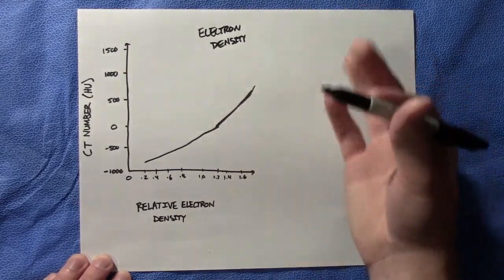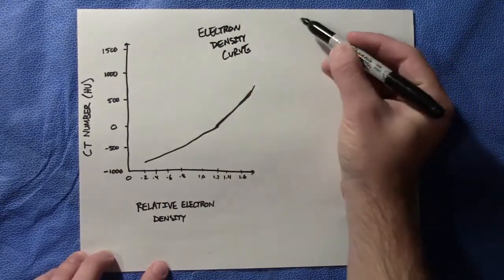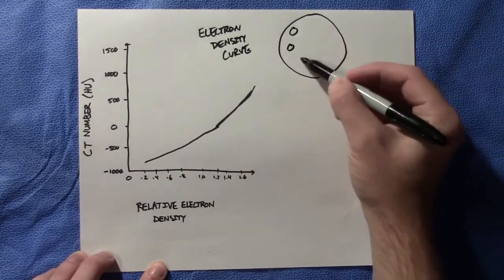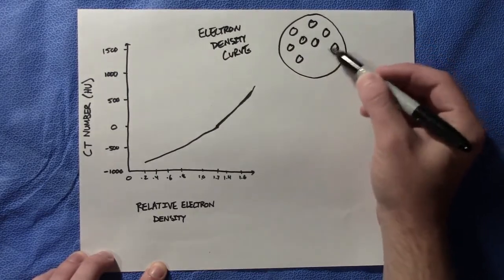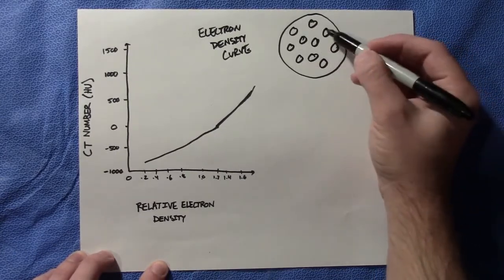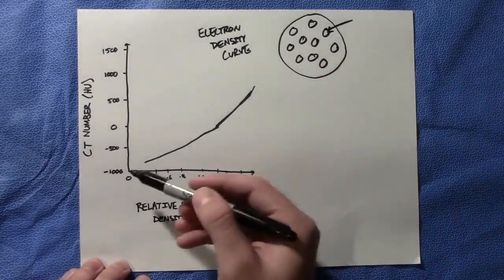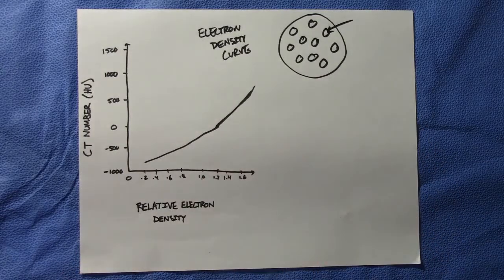They typically come with the CTs that have those materials, and it's kind of just like a cylindrical phantom, and they have different plugs of Teflon, acrylic, something water equivalent, and you know, for example, what the electron density of this plug right here is, and then you can measure it and just create a plot of the CT number versus relative electron density.